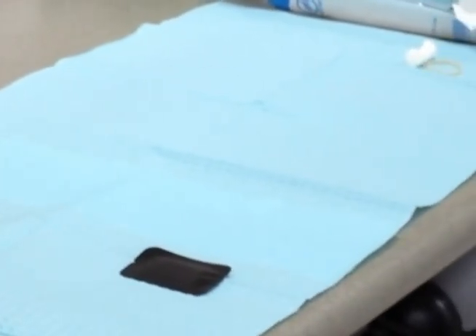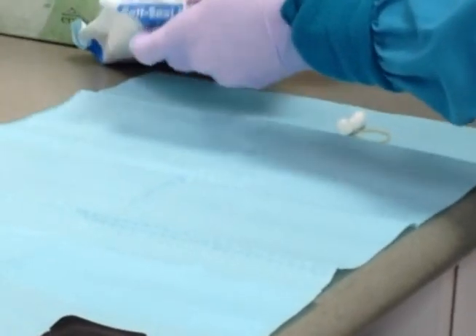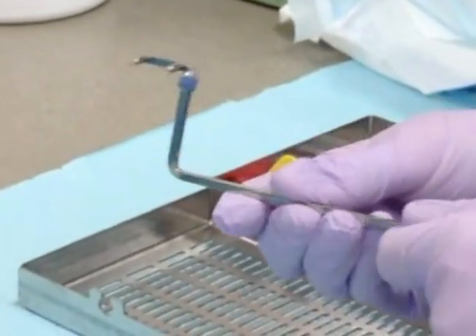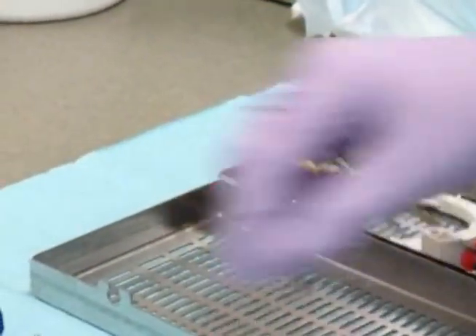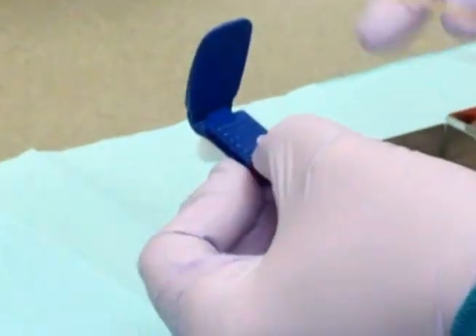Next, open the cassette on the blue napkin and locate the XCP instruments you will need. We will be using the rod that is the straightest and attaching the blue bite block along with the blue circle apparatus to the rod. If you do not have a blue circle apparatus, then it is the one that is not off-centered. Before connecting the rod to the bite block, you will want to attach a cotton roll to the side of the bite block opposing the mandible by using a rubber band. This aids the patient in biting down on the bite block.